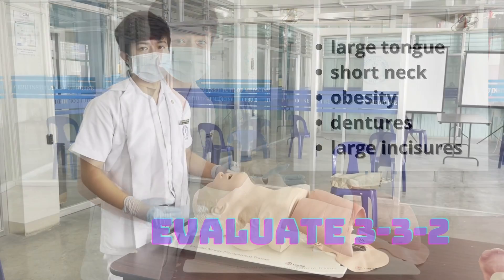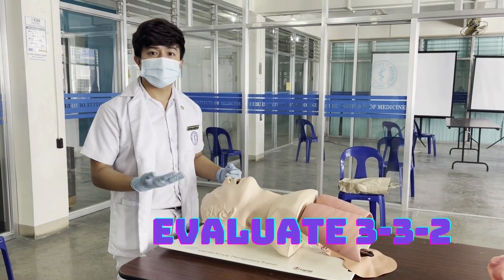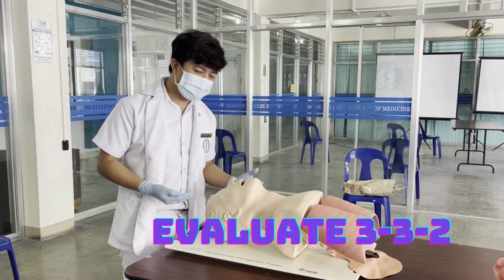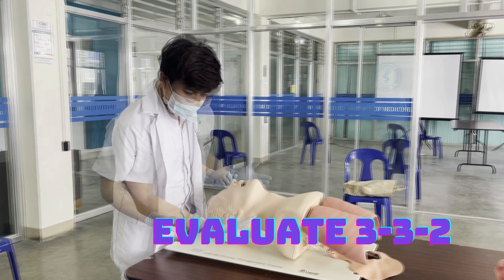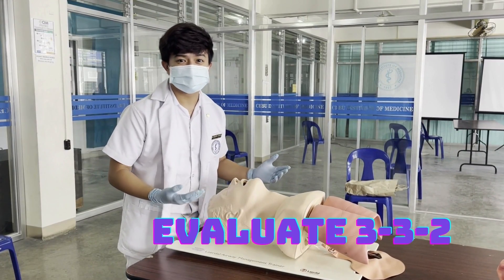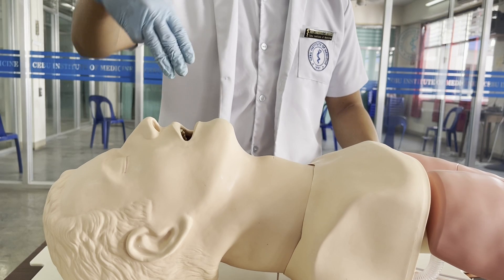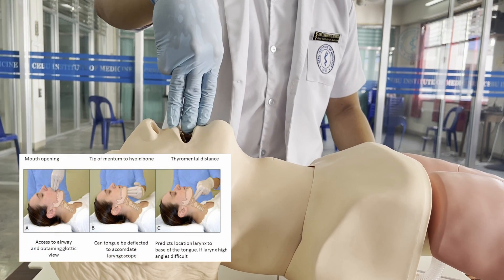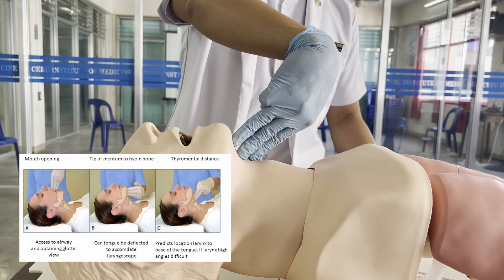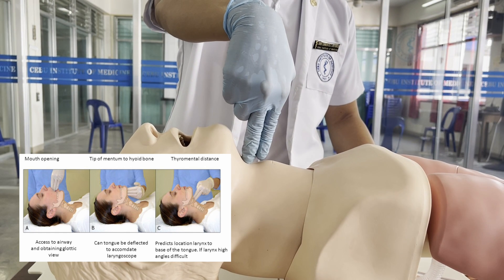Evaluate the 3-3-2 rule, which is an assessment tool used to predict difficult intubations. This functions to estimate whether the anatomy of the neck will allow for appropriate opening of the throat and larynx: 3 finger breadths for the mouth opening, 3 finger breadths for the hyoid-mental distance, and 2 finger breadths for the thyromental distance.